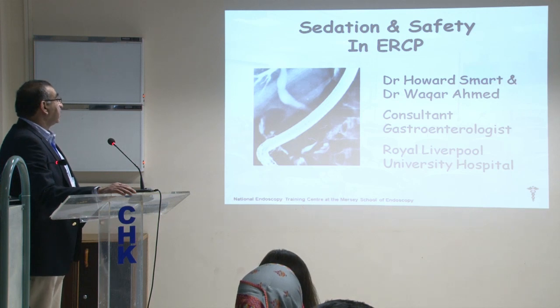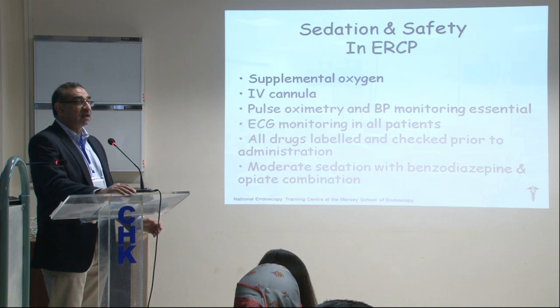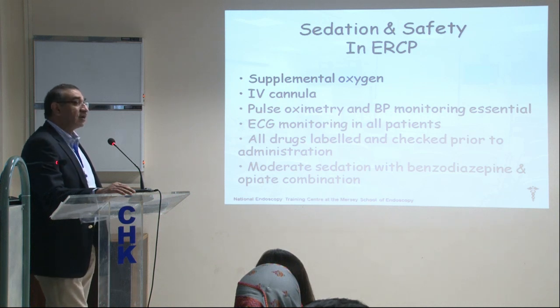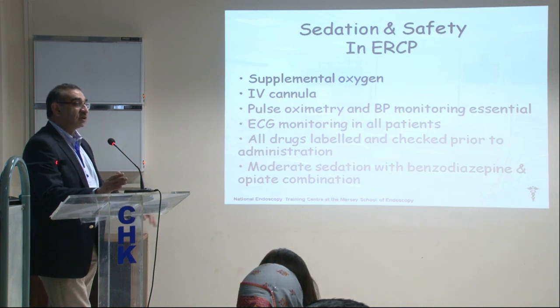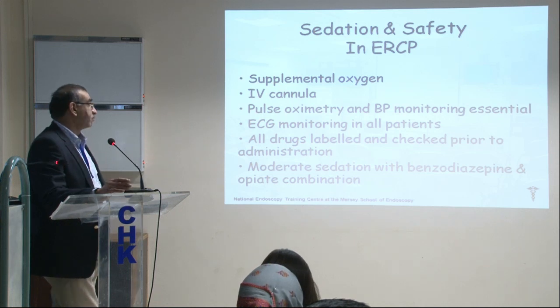Right. Sedation and safety in ERCP. Now, again, one of the things that came out of the big audits that were carried out in the UK was that we suddenly found out that most of us were over-sedating the patients. And nowadays, this is an auditable item. I am audited on how much average midazolam and fentanyl I'm using in my patients, and it is audited for patients above 70 years of age and for those below 70.